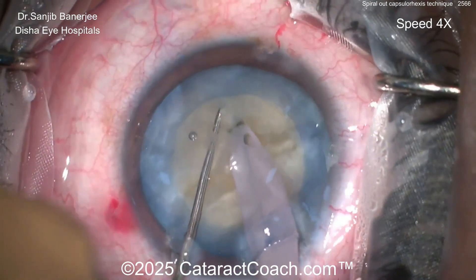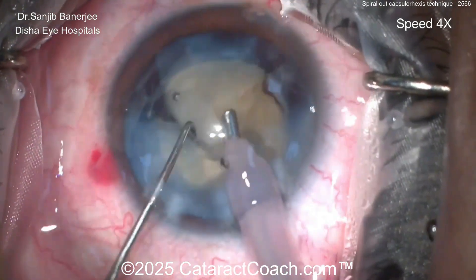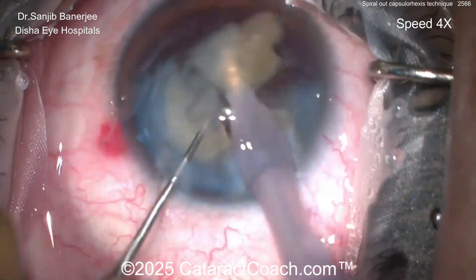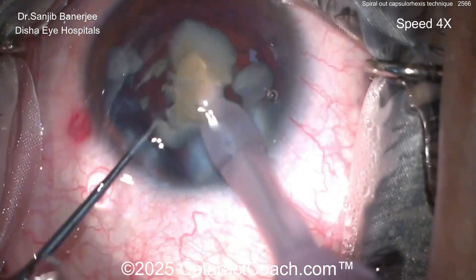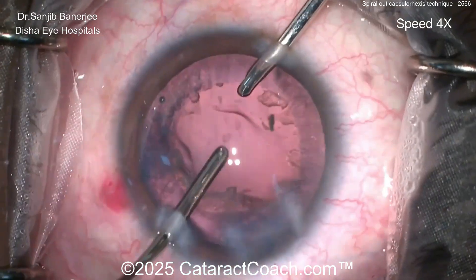The patient can now have a beautiful cataract surgery — the rest is our favorite: chop, chop, chop. We'll speed the video up here. These white cataracts are actually nice and easy to chop typically. You have good visualization of the blue rhexis edge from the trypan blue. Take these pieces out — pow — and put that new lens in.